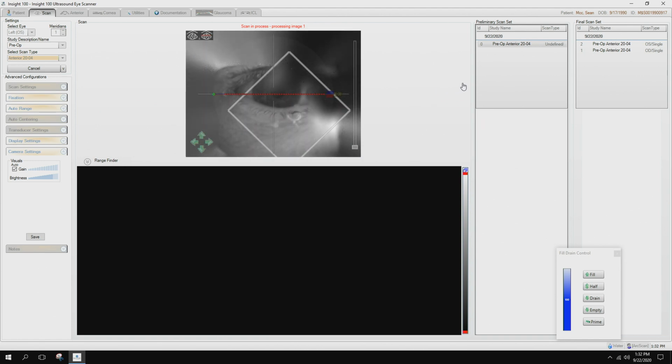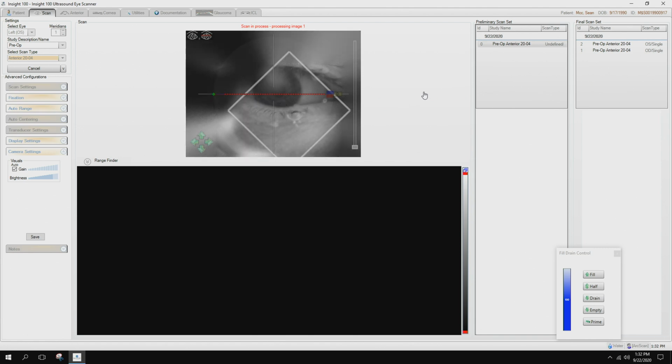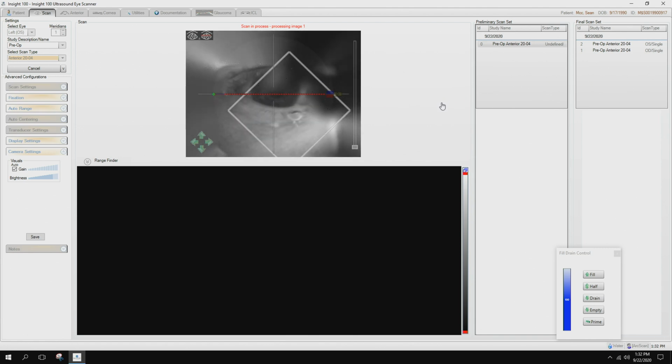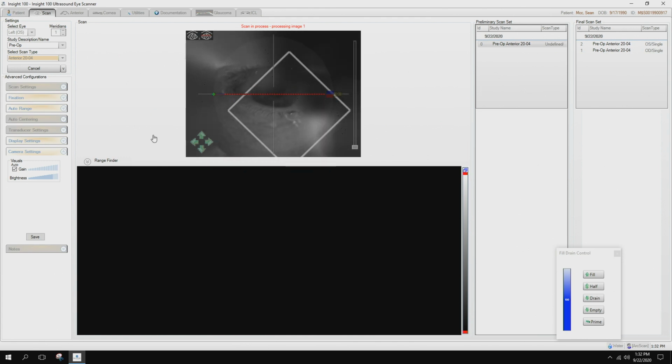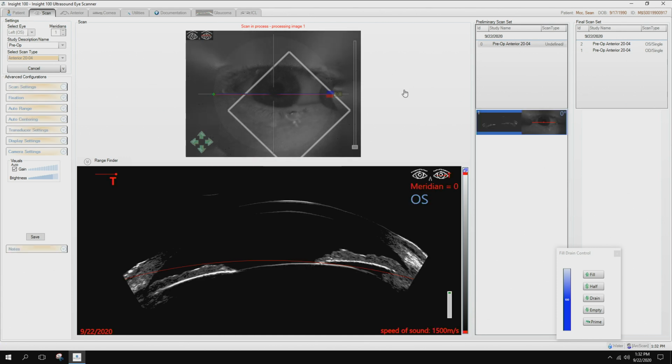If those bubbles don't want to clear, you've already filled that eye seal. That's mistake number one. At this point, you can't recover. So the idea is to now have the patient try to come back. Although we're getting a bit of an image here, you've initiated it, it's well off center, and the images could be much better than what we're capturing here.